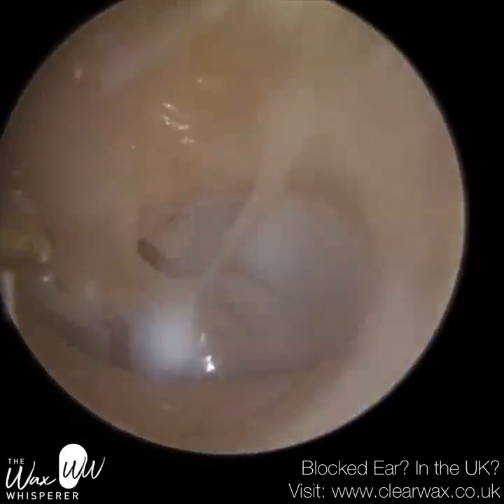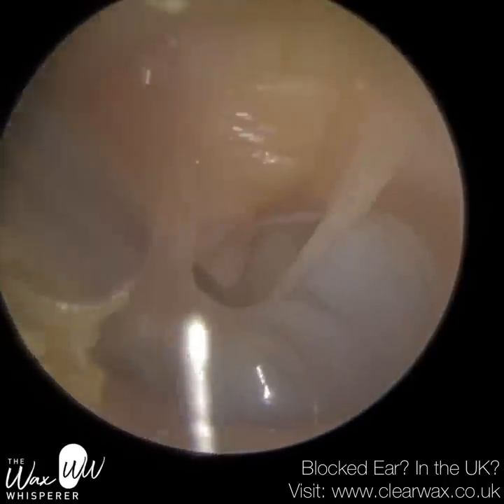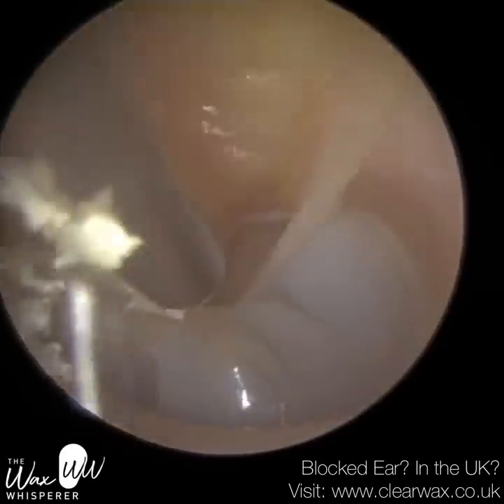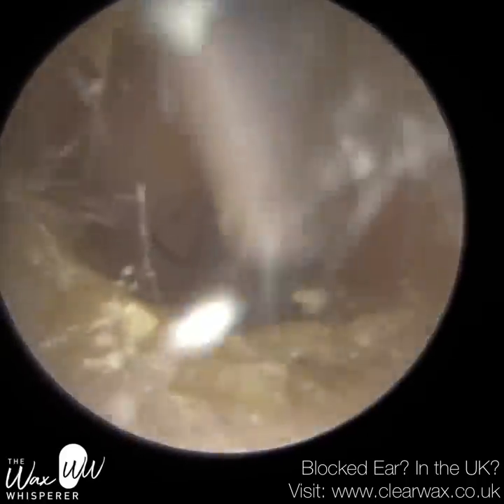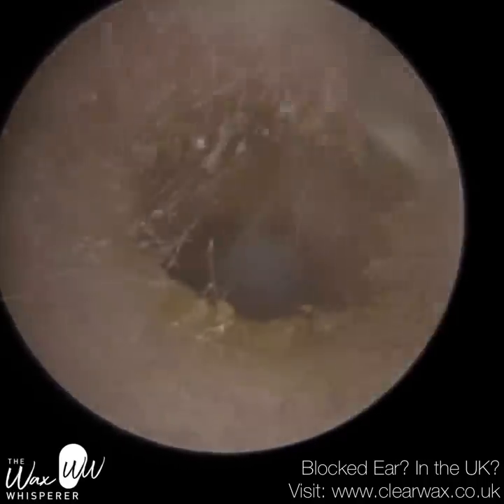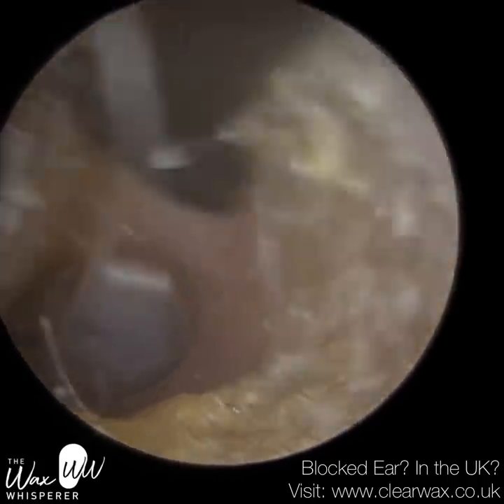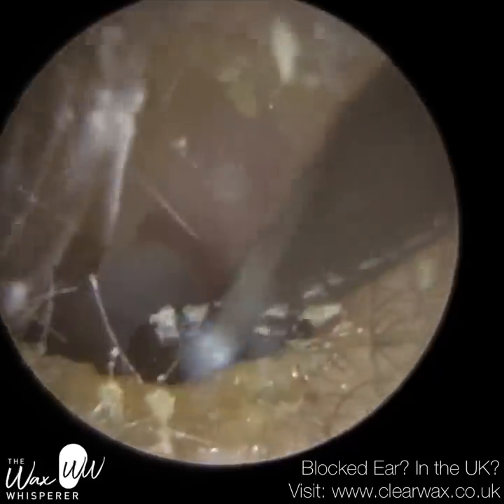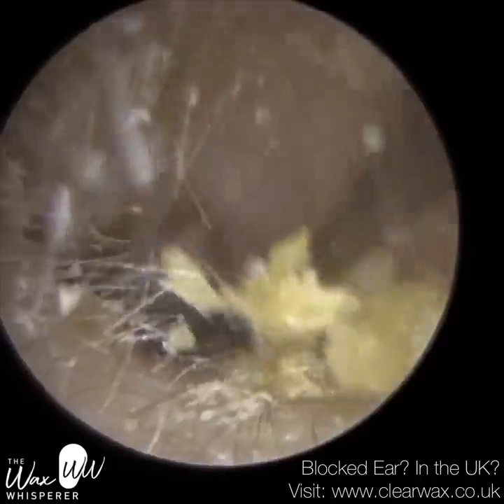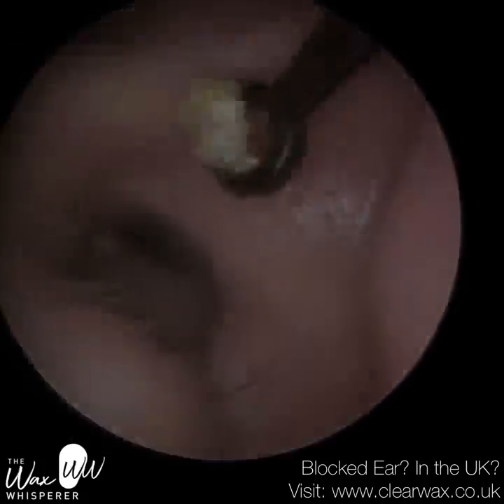We call that barotrauma — when water enters the ear at high pressure, it can perforate the eardrum. I'm just mopping up some dead skin around the edge. On the right-hand side where the perforation is, you can see some dead skin lining the canal in a strip — we call that a keratin trail. That dead skin is dying and shedding near the eardrum and migrating out. The keratin trail is probably a bit slower because of the perforation, maybe holding it up. That skin becomes oxidized and you can see it — we call it a keratin trail.